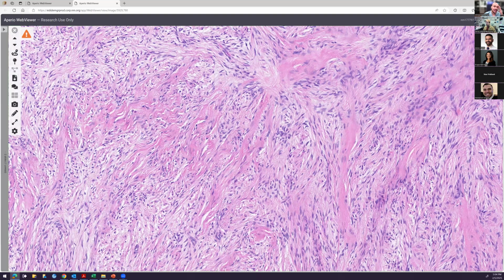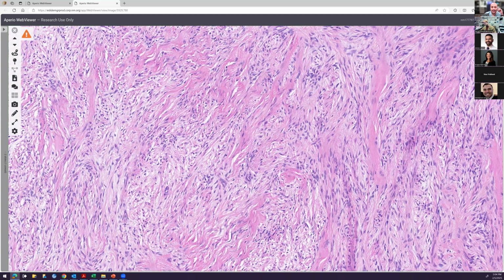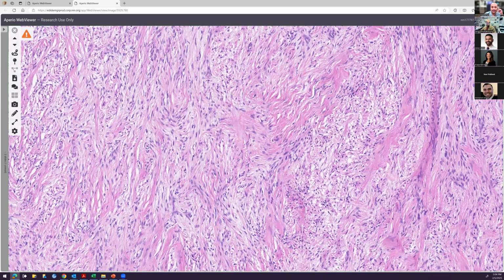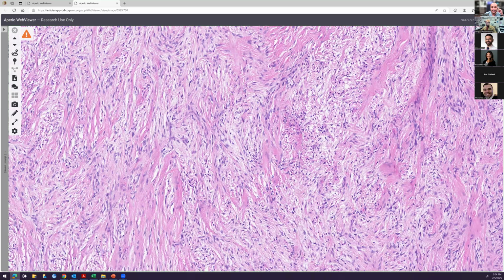Usually it's a superficial lesion that is multinodular. It's not infiltrating into the fat like this lesion. Right. Usually it's also a bit less cellular than this. And those tumors are pretty distinctly gynecologic in nature, so it's not actually something I'm going over. But good thought. What else?